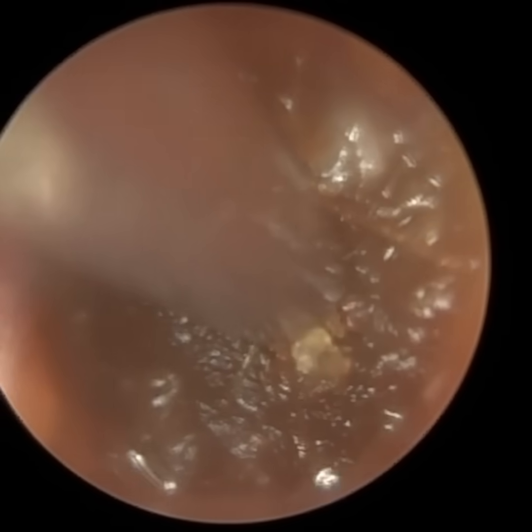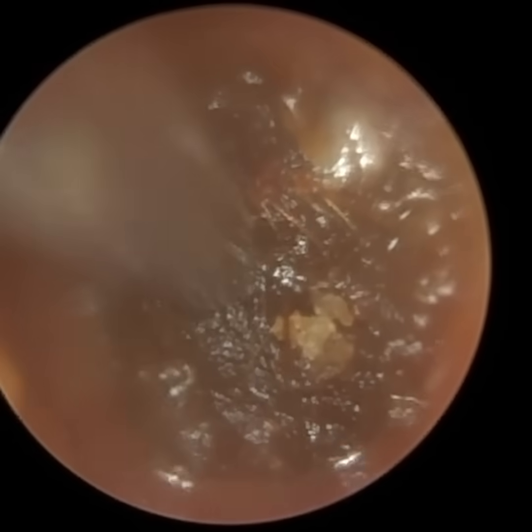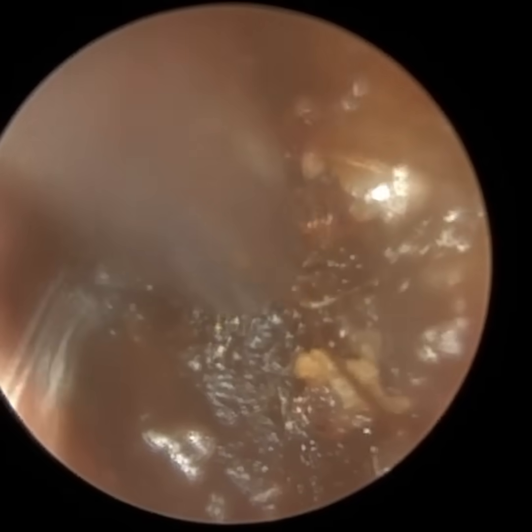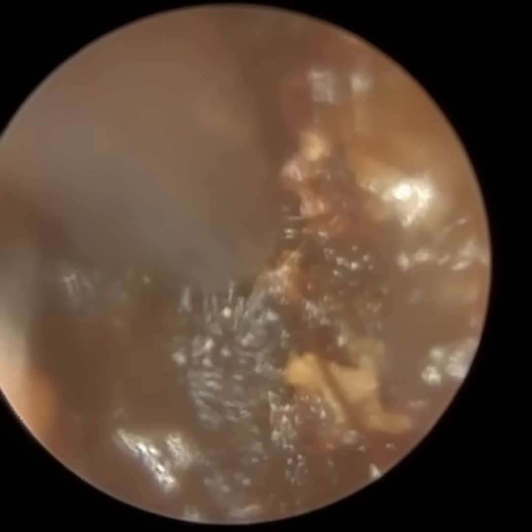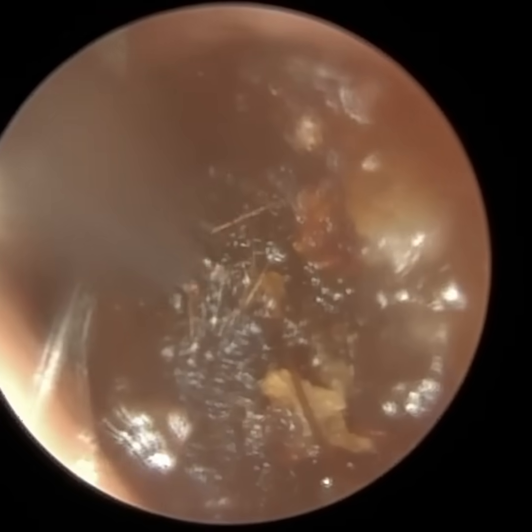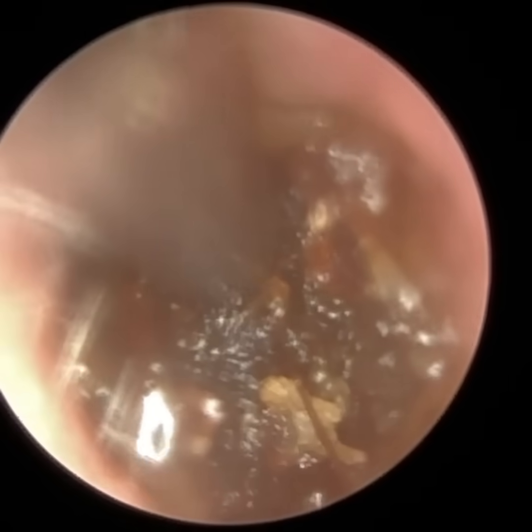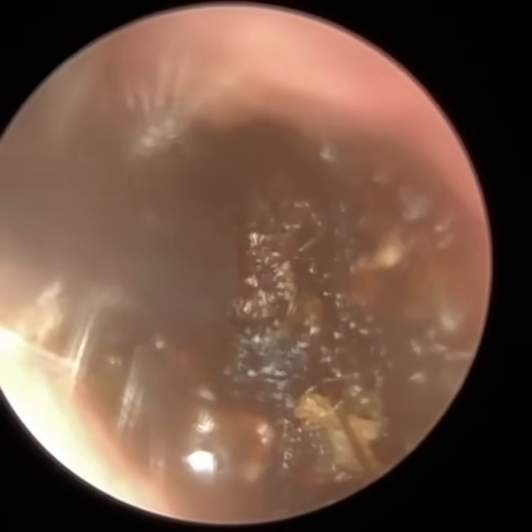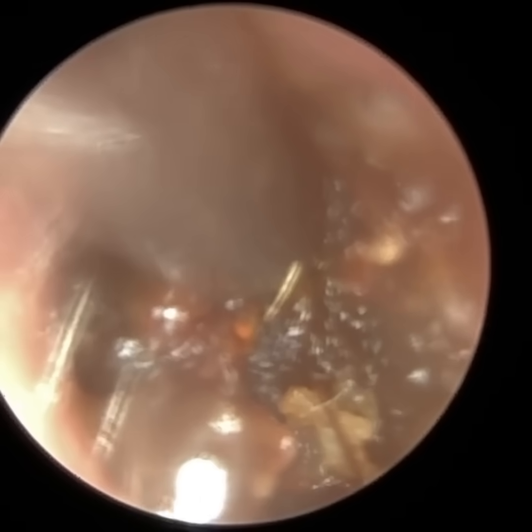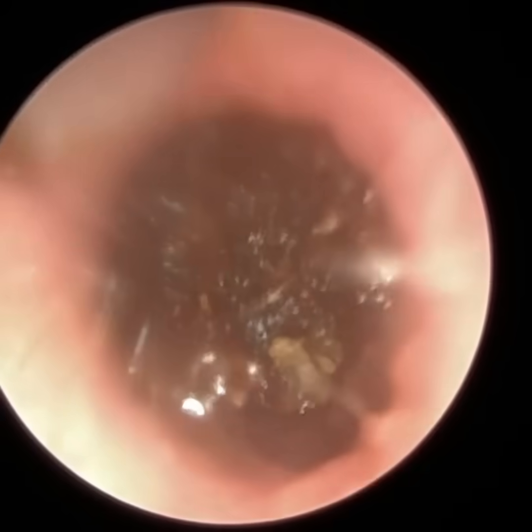Now, you can see I'm persevering with the 18 gauge. I've used quite a lot of drops, but when I was suctioning, it was almost pushing it back in. It's hard to get a suction grip because although I did put a lot of drops in, the wax was still a bit firm on the surface, and then you always run the risk of pushing it in when you're trying to get a suction grip. And it happened on a couple of occasions. So the key here is to almost kiss the surface of the wax and allow that suction power to intensify, so trying to get an airtight seal between the suction tip and the wax. And then once you do, you come away really, really slowly, but it just wasn't going to budge.